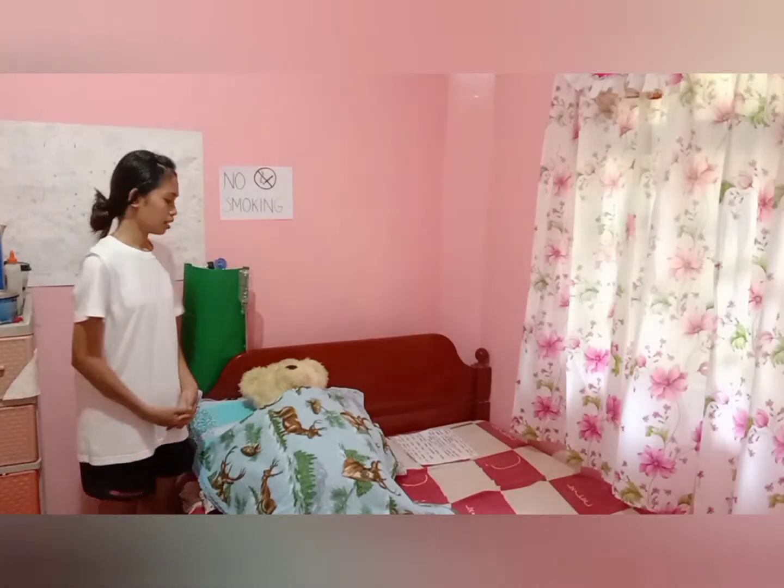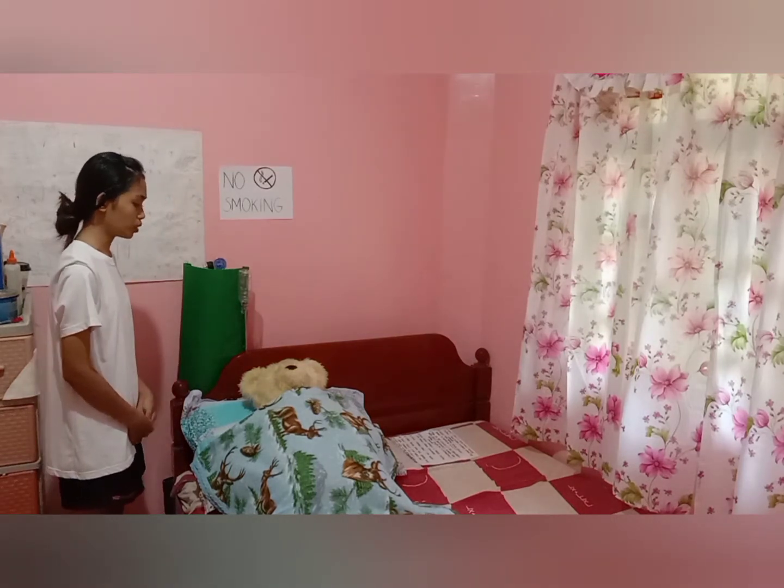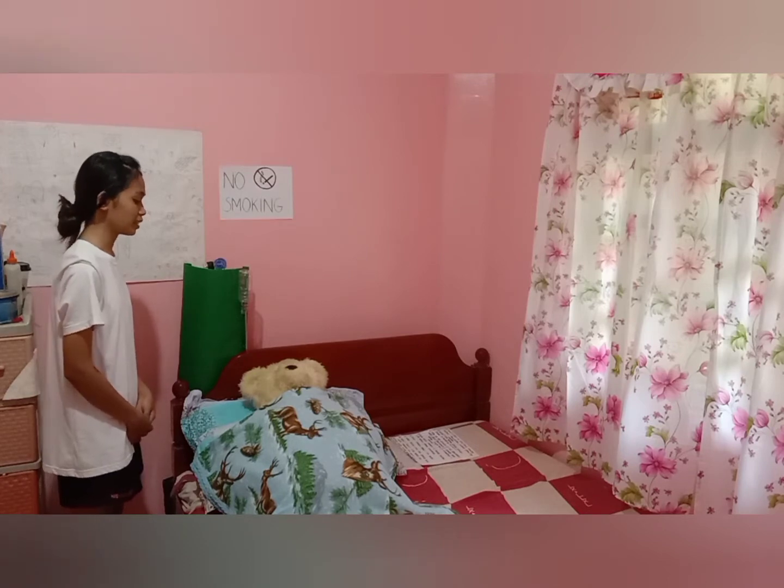Before that, we need to introduce ourselves to the client. So, good day, ma'am, sir. I am Janice Asuncion, the student nurse assigned to you today. Today, I will be administering oxygen to you via the nasal cannula. So, next we need to identify the client.